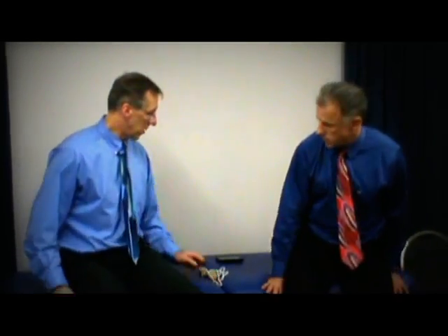Right. And so a lot of times when we have people work pulley systems, we just have them work down here and then every so often stretch it up. Right. But just that very movement helps keep the joint more healthy. Keeps the fluid moving in there. Yeah, keeps the nutrients going. So, Brad, can we just go over here and show a pulley system here first?